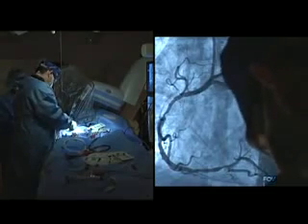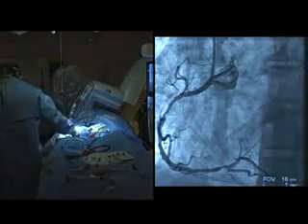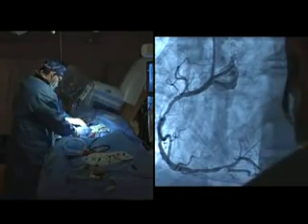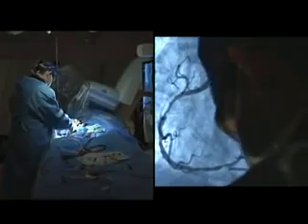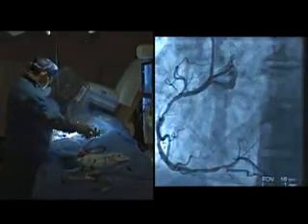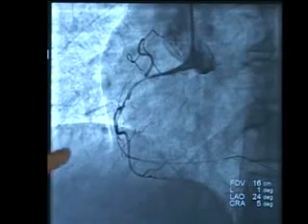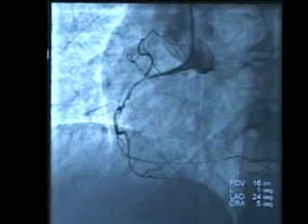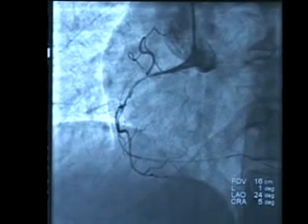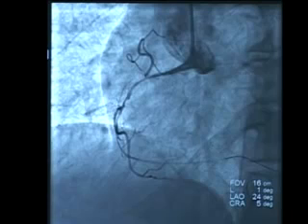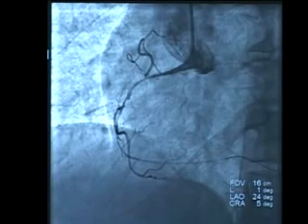We made several passes with the thrombus removal device called the export catheter and had a very nice result. Now we're going to finish the procedure by stenting. The first picture shows after one pass of the export catheter, the second after one pass of clot removal, and then two more passes with the export catheter and one balloon inflation at the beginning of the artery — and that's how we ended up with this result.